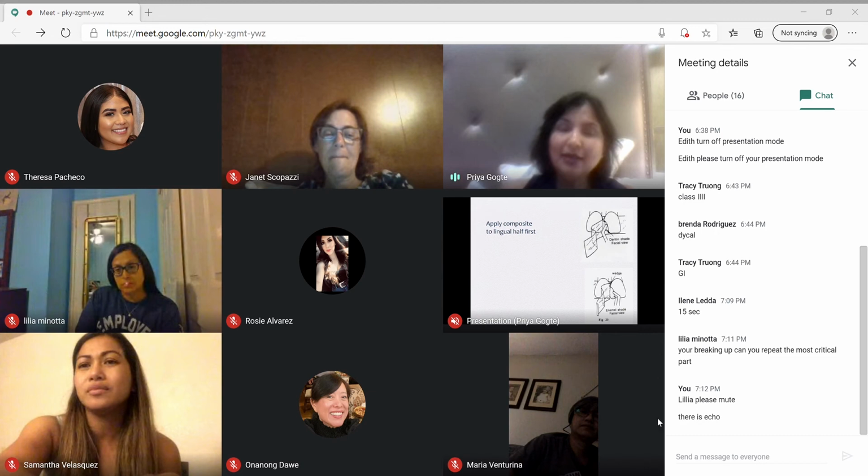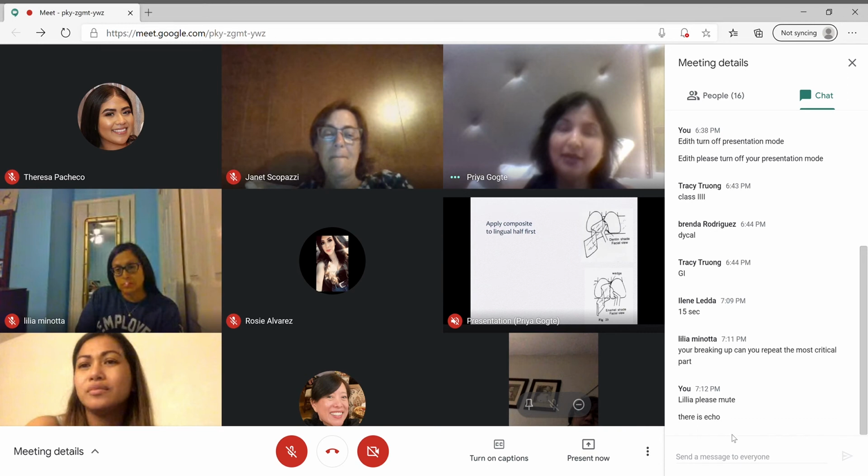Translucent shade comes in light and dark, so look at the patient's tooth and decide whether you want to use a light or dark translucent. I have used light translucent, and I feel it is very light and has given me a lot of gray color in the tooth, so I've not been very happy with that. The dark translucent is, I think, better.